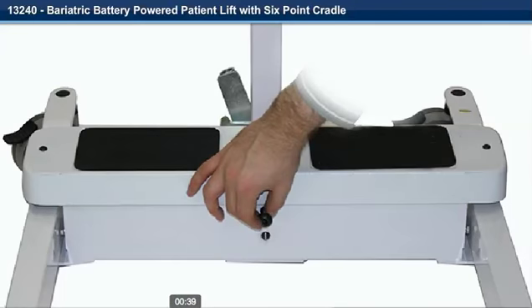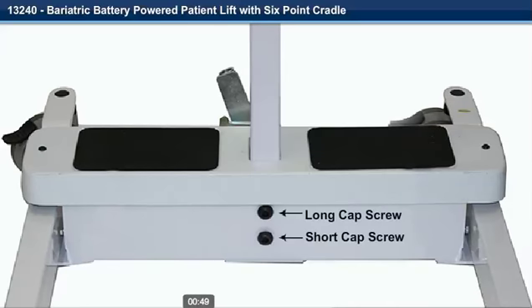Step 5. Install and tighten the two Allen cap screws with the provided Allen wrench. The longer cap screw goes on top and the shorter cap screw goes on the bottom.